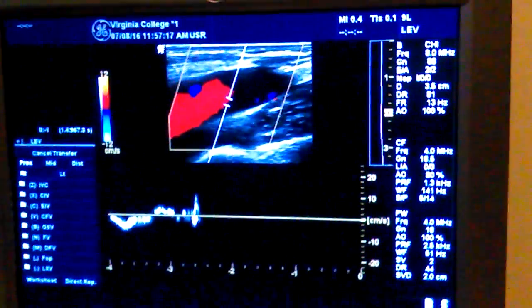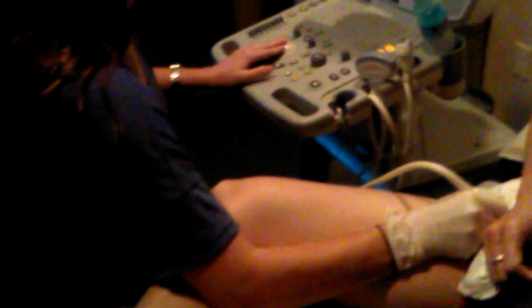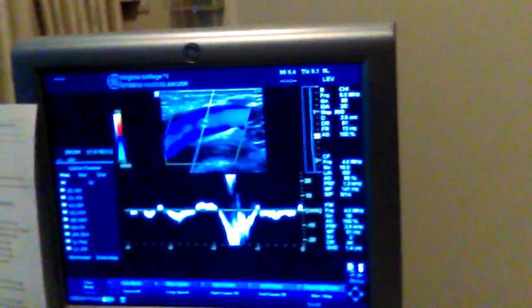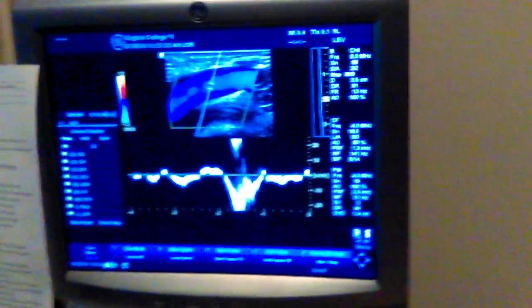Alright, and if we want to augment like this, we want to go ahead and get comfortable. Augment on with your arm on this way. No, you're gonna augment, but see, I'm just steadying my arm. I'm getting it anchored somewhere, so that way my hand's never moving. Because that was something that everyone struggles with, is trying not to move when you're augmenting. You have to anchor your arm down.